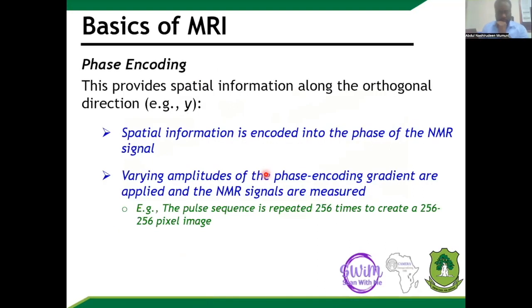All right. So the last step, the phase encoding step, is what then will repeatedly apply a pulse from bottom up. So if the human being is lying down on the couch, for example, we can assume that the phase encoding step will start building the anatomy from, let's say, the feet up to the head in that order.